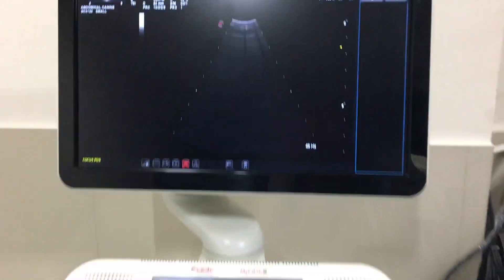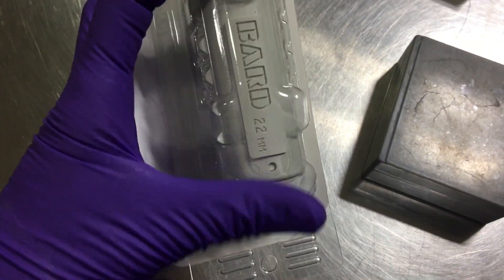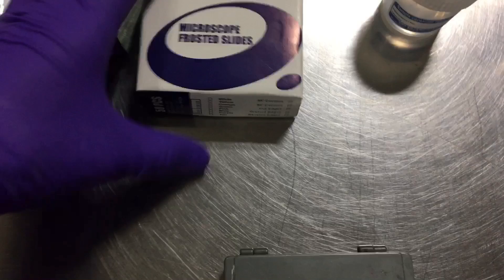In this video I am going to show you the protocols involved in ultrasound guided liver biopsy. Here we have a true cut biopsy needle which is 22 millimeter and 18 gauge.